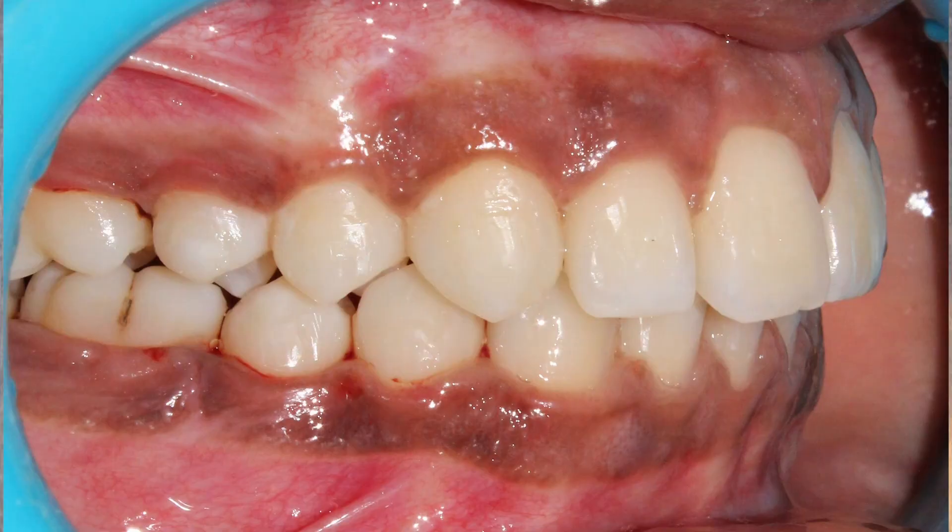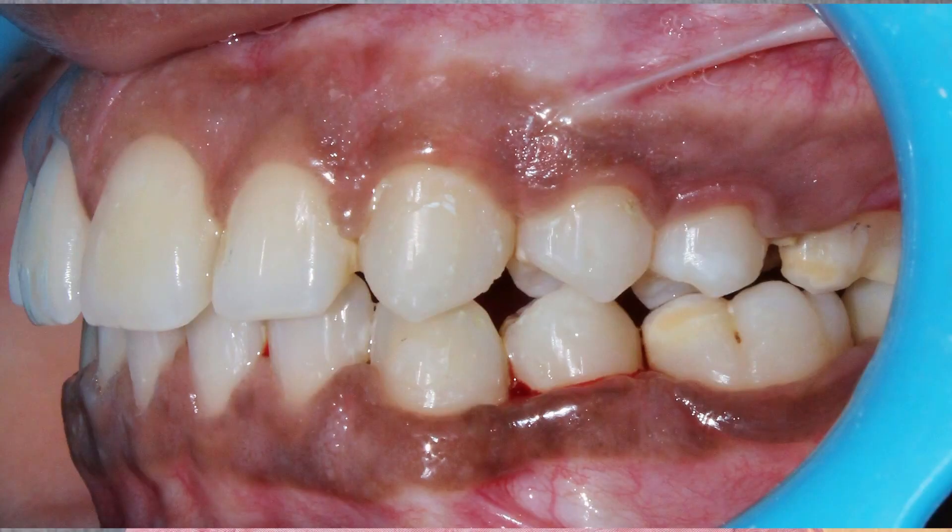All that remained was to align the teeth, correct rotations, and close spaces, which I did with a .017x.025 NiTi arch wire and .019x.025 SS, and settling was completed. After debonding, the patient had a normal occlusion on the right side. However, due to ankylosis and mesial drifting of the molars on the left side, the occlusion was slightly off on the left side.